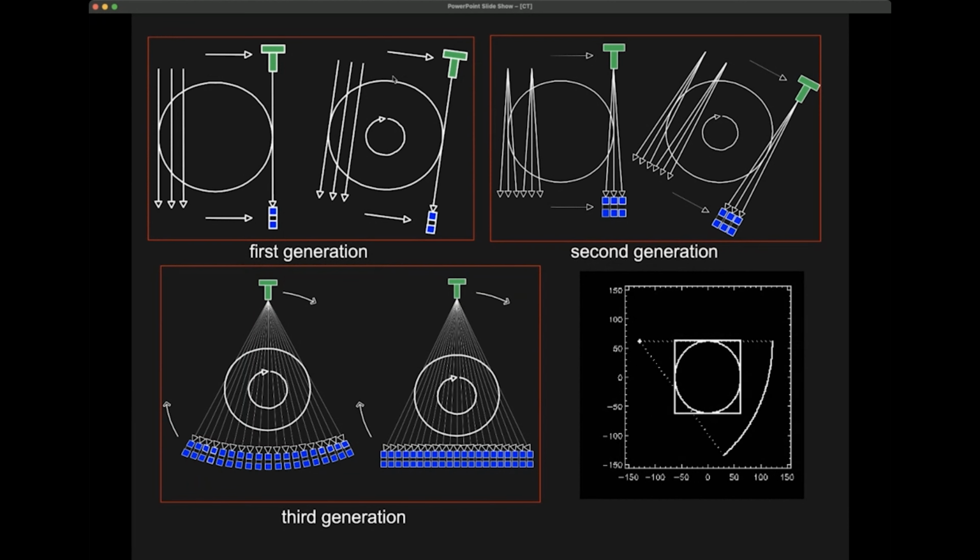Theoretically, 180 degrees is enough, because as you know, if you go from the X-rays from the top to the bottom, or the X-rays from the bottom to the top, you cross exactly through the same amount of atoms and the same atoms. So that means that the absorption would be exactly the same if you go in one direction or the other. Very often we do the 360 degrees in order to get a better signal to noise ratio, for example.